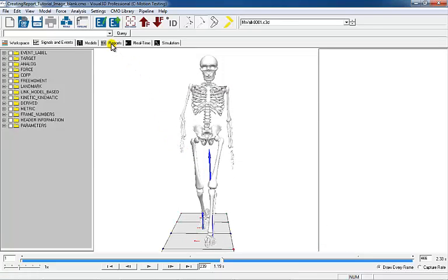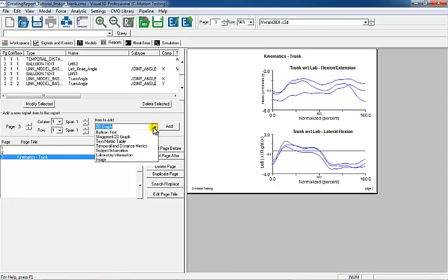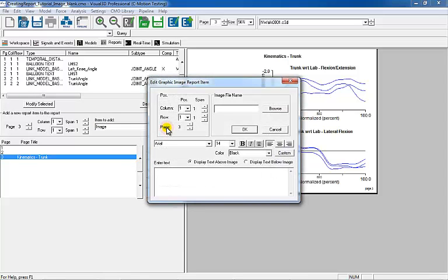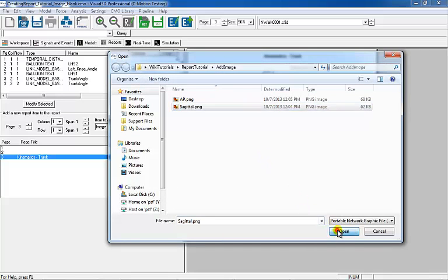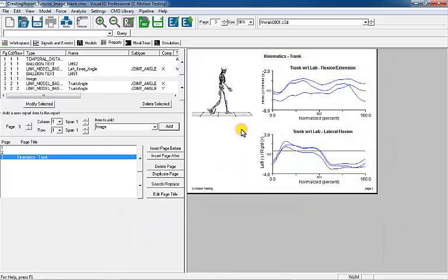Once the images have been exported, go to page 3 of the report. Set the item to Add as Image and browse to the sagittal image just exported. Make sure the column and row numbers are set to 1, while the page number is set to 3.